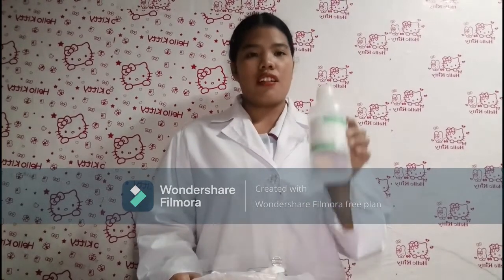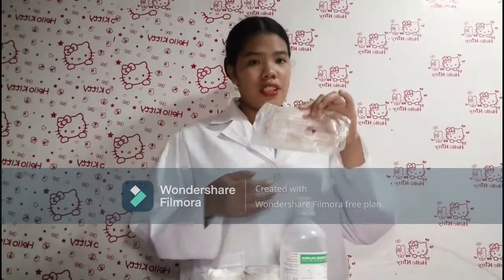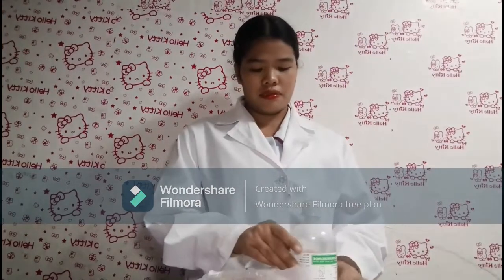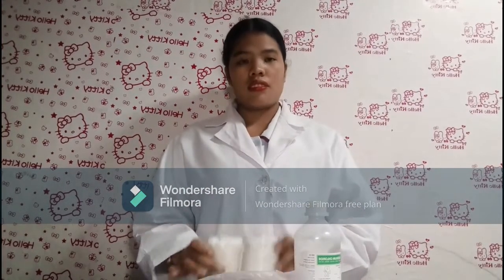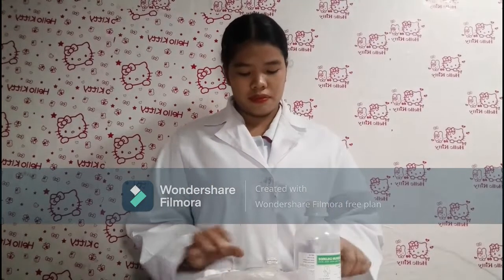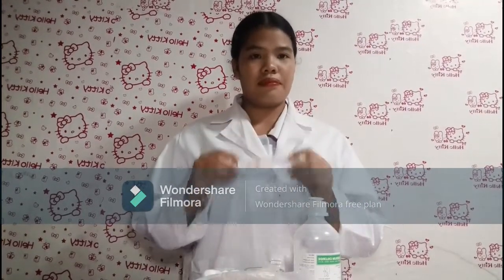The equipment that we need for this procedure are the IV fluid, the IV tubing, the tourniquet, the cotton balls with and without alcohol, the surgical tape, the scissor, and the IV cannula.